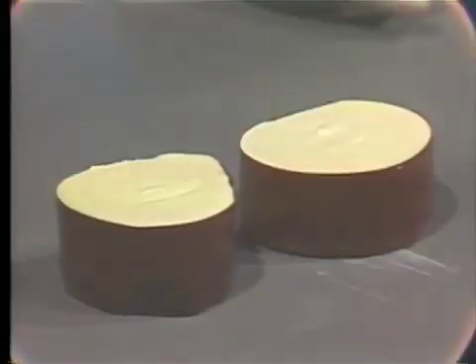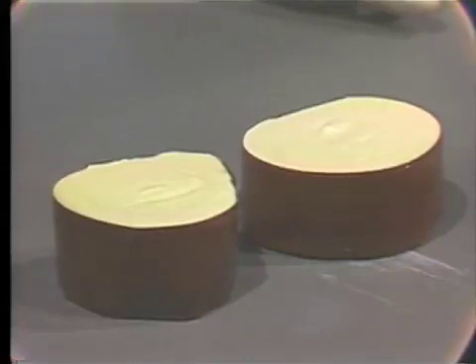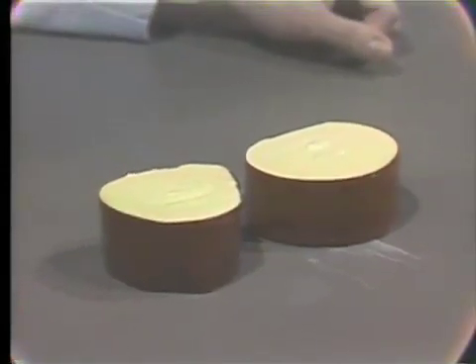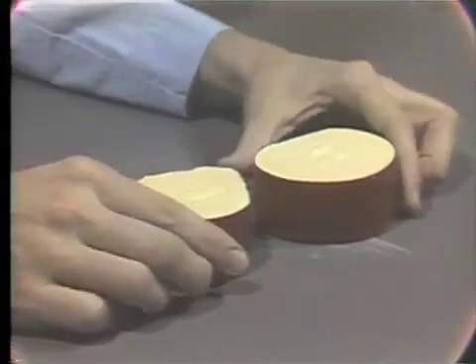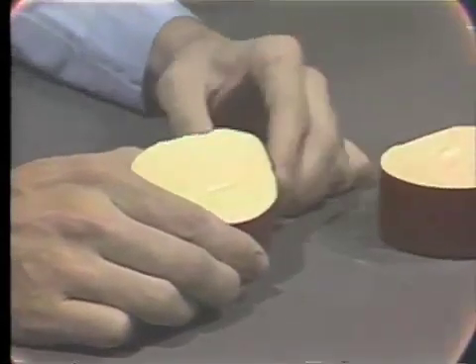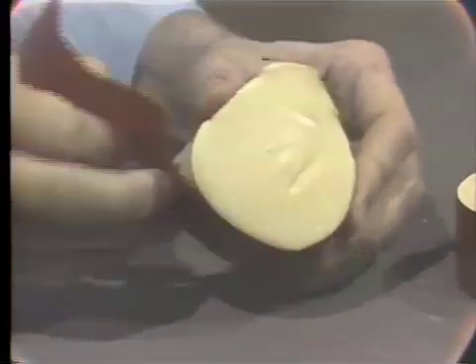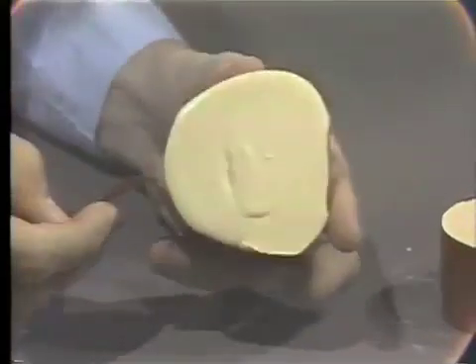The mandibular boxed impression is poured in a similar manner, and after the appropriate waiting period for the stone to set, the models may be separated from the waxing strips and prepared for the next step in our denture construction. The maxillary master cast is relieved of its boxing strip and examined carefully.